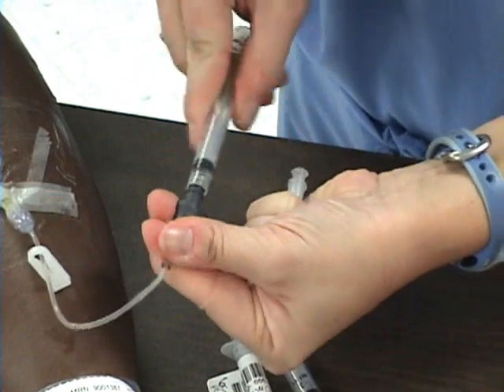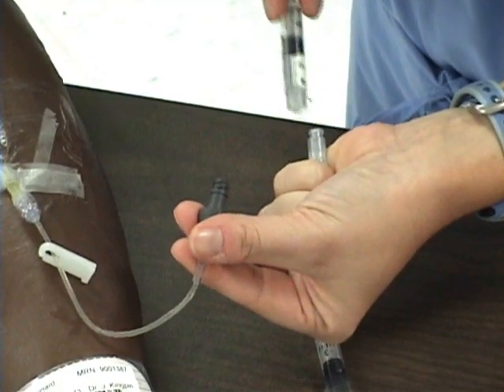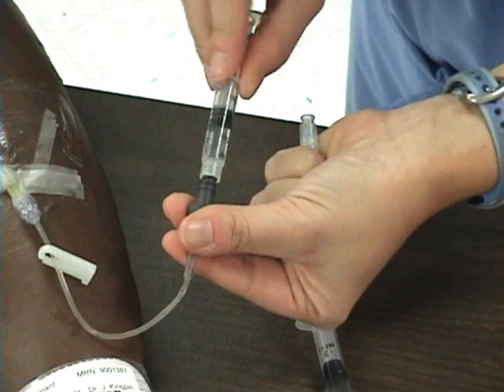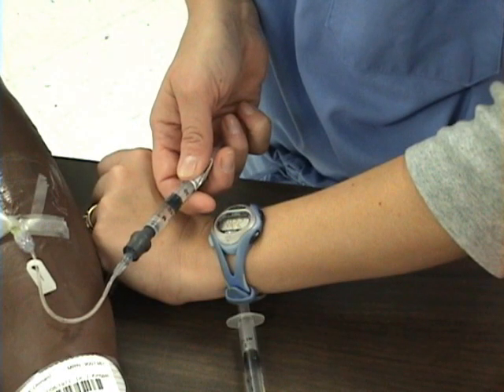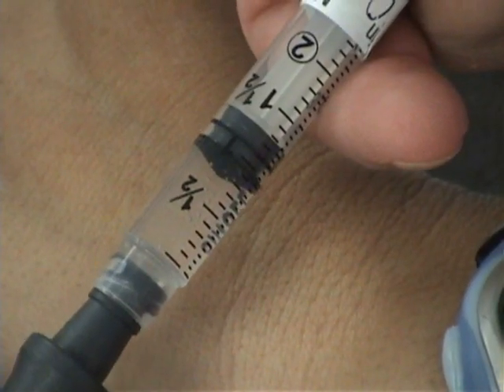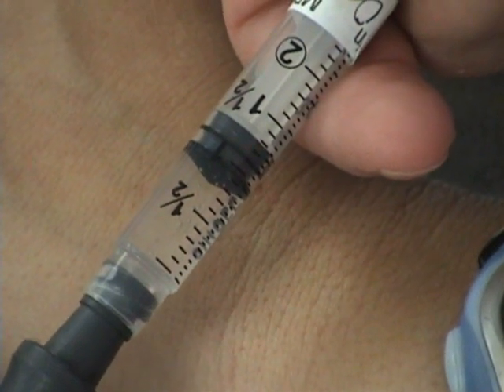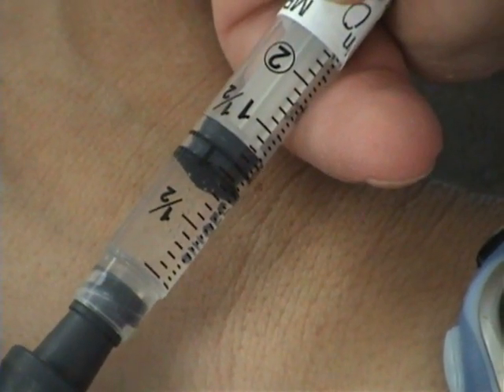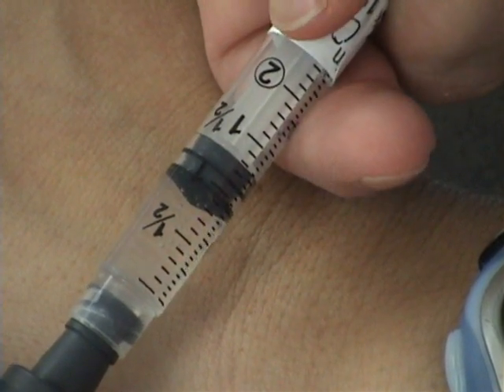I will dispose of the syringe and cap in the sharps container. Next, I will attach the Reglan to the saline lock. I am going to be looking at my watch and the markings on the syringe at the same time. I now will push this medicine at a rate of 6 seconds per line. It should take me 6 seconds of a continuous push from one line to the next.